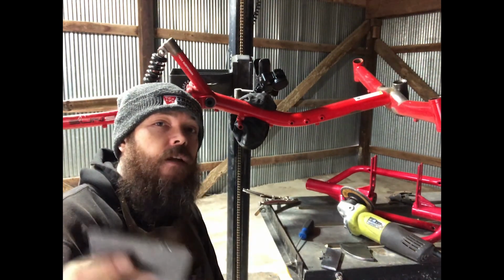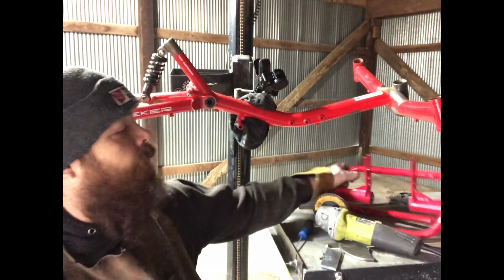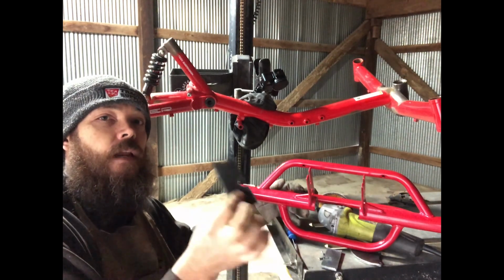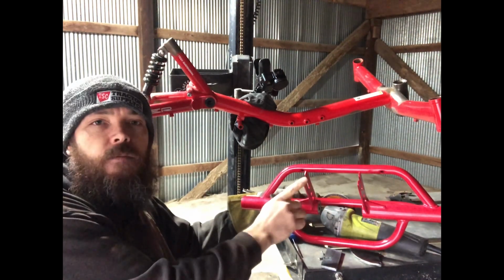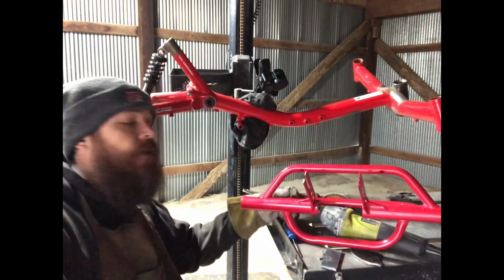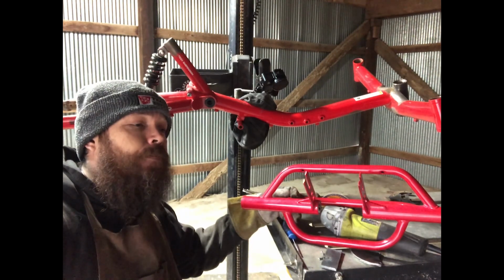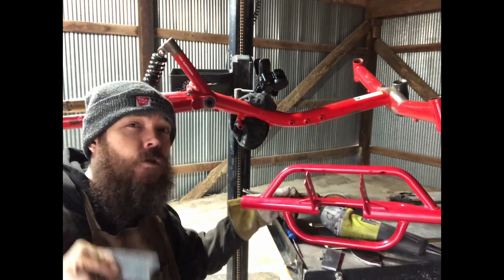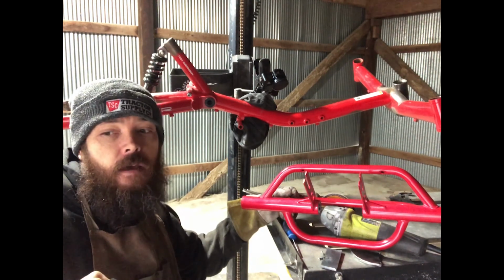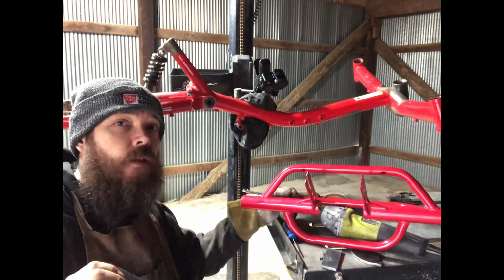So I have a couple components here. I have this one, which I have made to go into the back, which will replace these pieces right here. We have these long uprights, and I'm going to replace them. That's only about, let's say, 3/16 thick plate, not very thick at all. For this, we're going to go to a 1/4 inch thick plate. This is going to be heavy duty, especially with the bigger motors, the 3,000 watt, the 5,000 watt. Just that motor alone, I want to say, is about 25 pounds. I know for sure the 3,000 watt is at least 20 to 25 pounds, and the 5,000 watt is at least 25 to 30 pounds. It's pretty heavy, so keep that in mind. That's a lot of weight to be sitting out there.